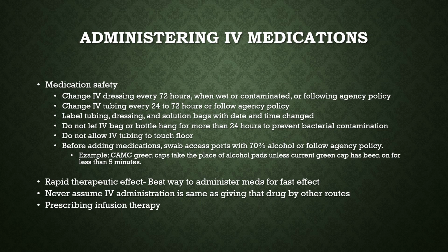So you want to be cautious. Also, if you've been working at the hospital very long, you know that you'll find that IV tubing literally up a patient's butt crack. They will pee on it, they will vomit on it, and if they're incontinent, it'll be laying in it. That tubing gets so dirty. So we want to, again, make sure that it's changed frequently and taken care of. When the patient's in the bathroom, we don't want them to sit down on the toilet with the tubing up underneath them.